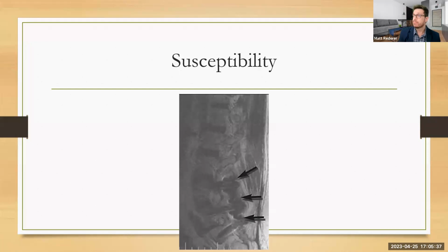This dark, swelling, voidish looking artifact in our image we call susceptibility artifact. Now, we get this typically from metal, so the patient has an implant or a device in their body. But essentially, all it is is an artifact caused by something that has magnetism to it, what we call susceptibility or magnetic susceptibility.